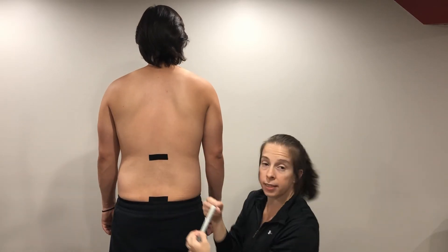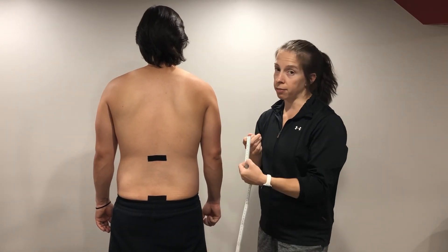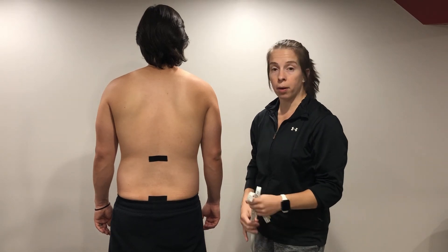Go ahead and come back up. That is now 11 and a half centimeters. I'll take 15 centimeters and subtract 11 and a half to get my final measurement, and that is how we get lumbar extension.